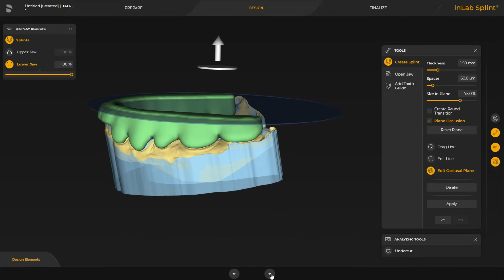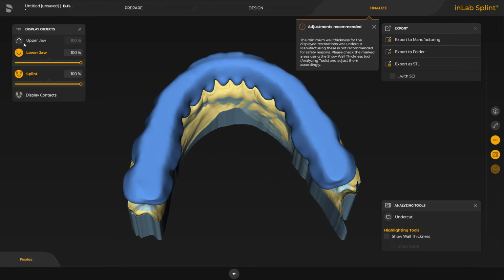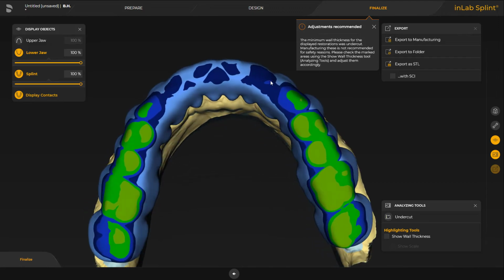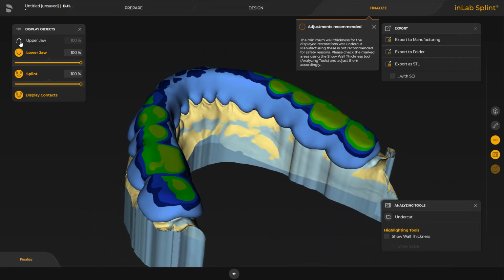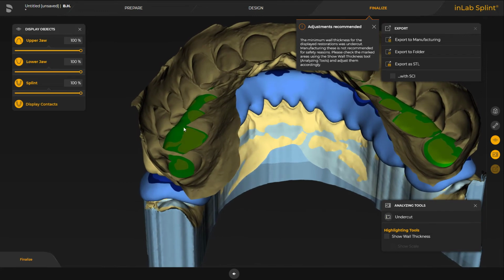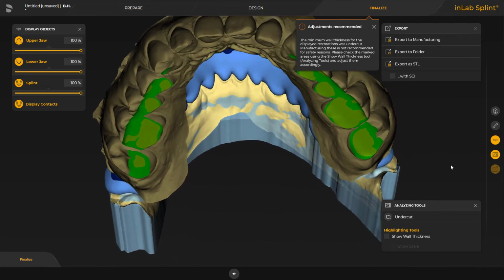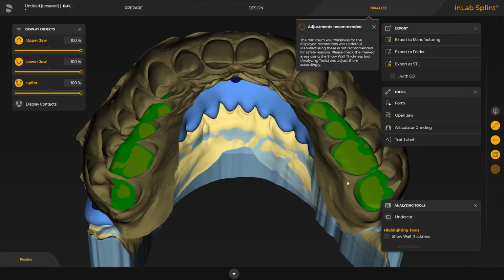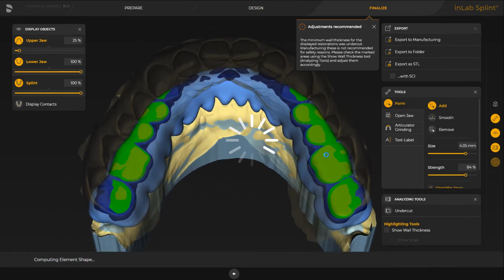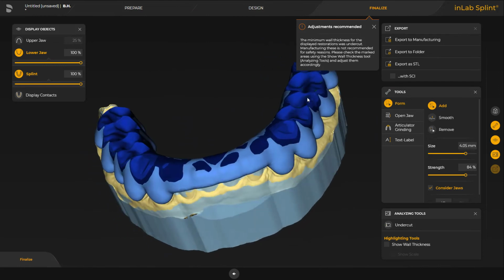We are going to go further into changing my occlusion. I will show you the contact points first. So you see here no contact on the anterior region and strong contacts on my posterior region. It's so strong, it's going through the jaws here. So to make it easier for me, I could use now my form tools, or for example, activate consider jaw, and now the occlusion will be grinded according to the surface onto my opposing jaw.